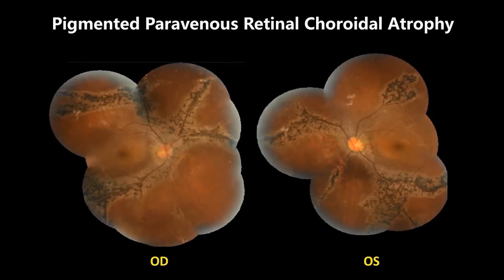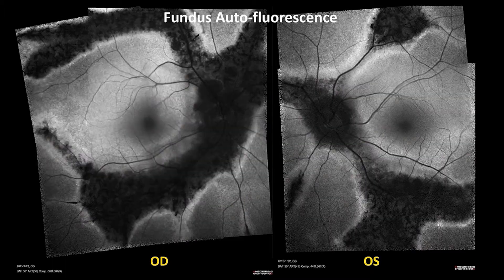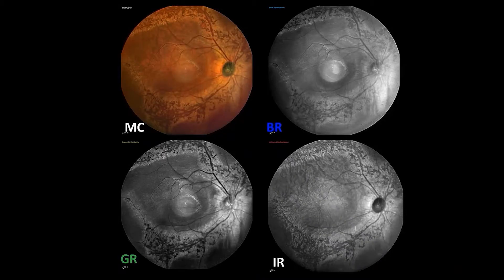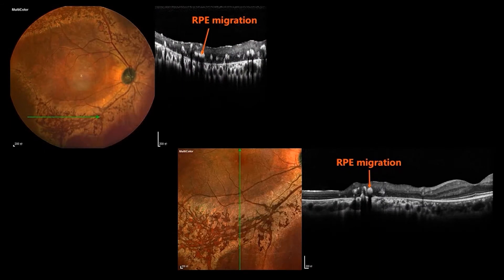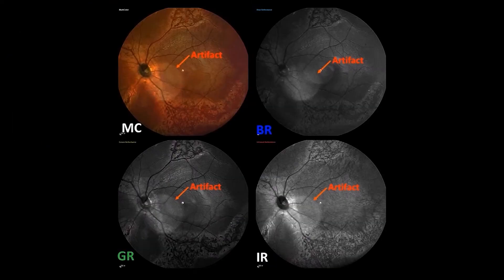Here comes a rare disease — pigmented paravenous retinochoroidal atrophy. There are large areas of hypofluorescence along retinal veins on fundus autofluorescence. Multicolor and other wavelength reflectance showed structural changes. The deep red patches on multicolor represent RPE migration, which was confirmed by OCT. Similar changes are present on the left eye.